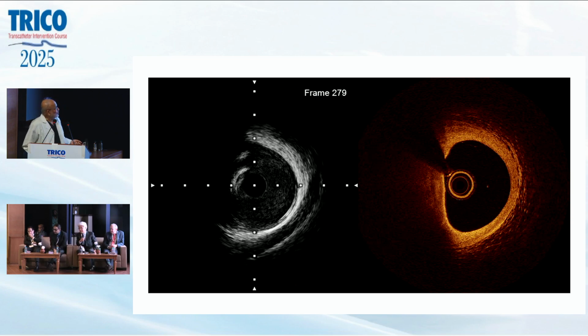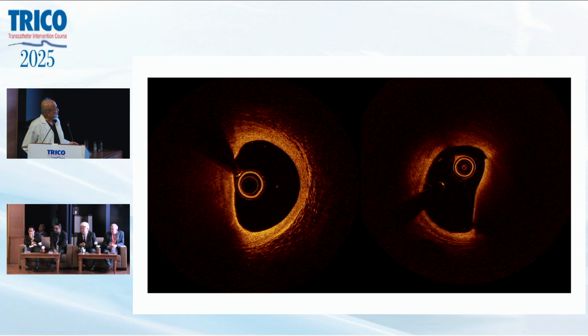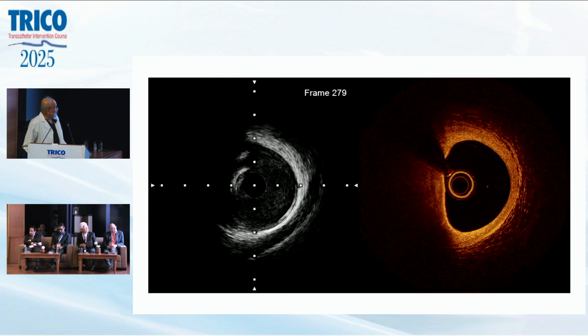Sometimes I have my interpretation that when I see this type of bulging with this type of image, I will always think that it could be hematoma, with a clinical presentation matching it. And if it's straight, and everything intact, I will think that it could be developing TCFA or what. But there are some areas which are still not very clear to us.